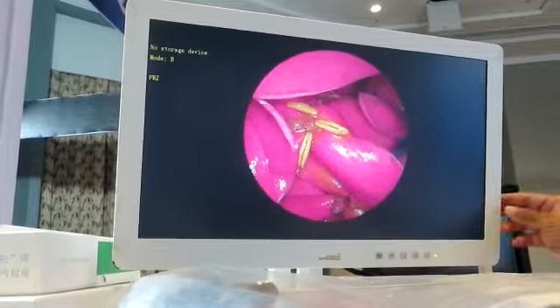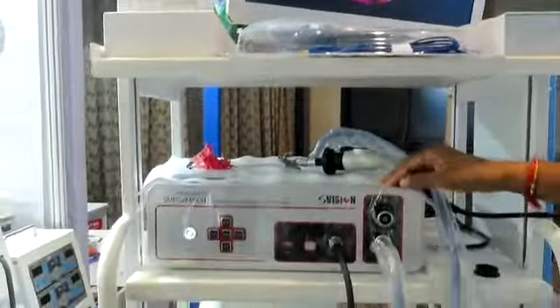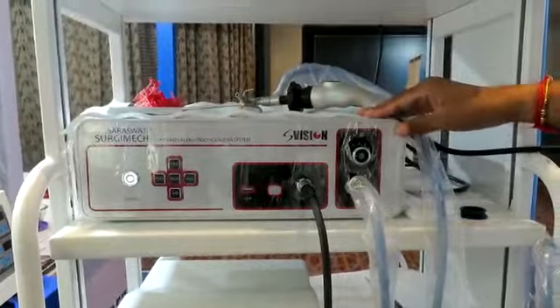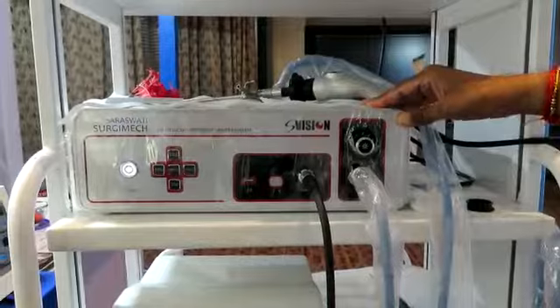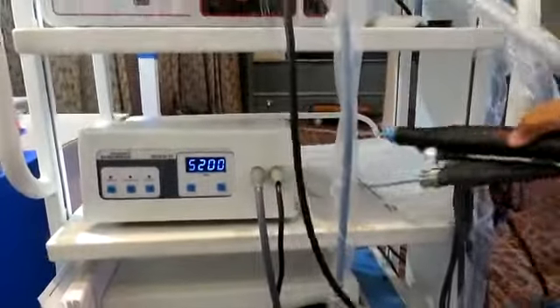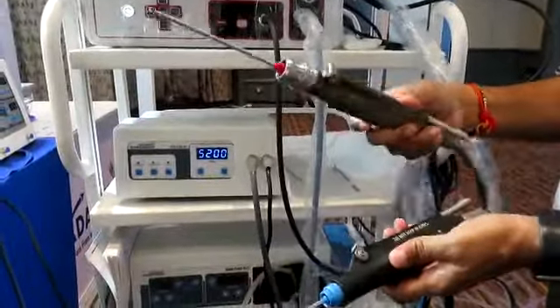This is a medical grade monitor — 22 inch — with a full HD camera, HD recorder, and LED light source, all as an integrated system. This is a shaver system with two handpieces: one for Dyonics and one for Stryker.